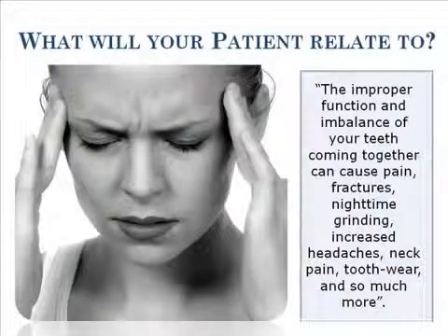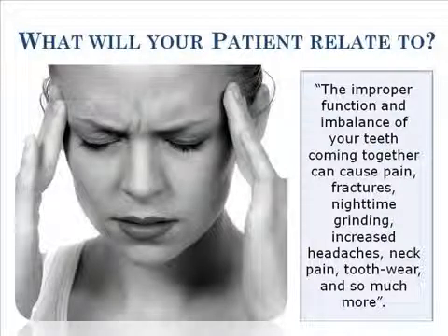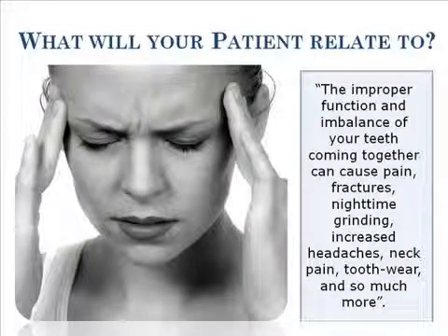State in terms that are easy to understand and hit close to home, such as, the improper function and imbalance of your teeth coming together can cause pain, fractures, nighttime grinding, increased headaches, neck pain, tooth wear, and so much more.